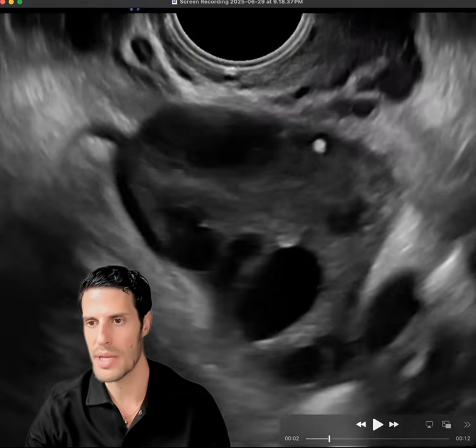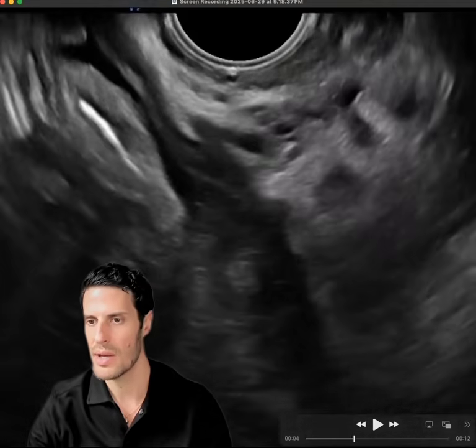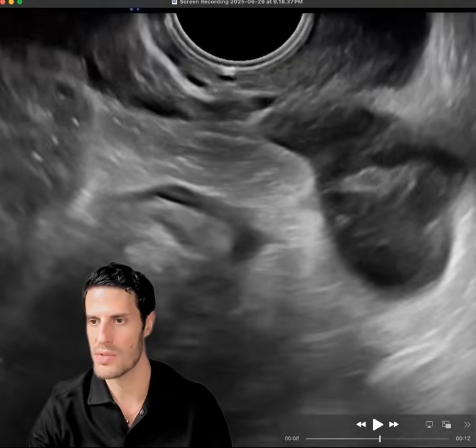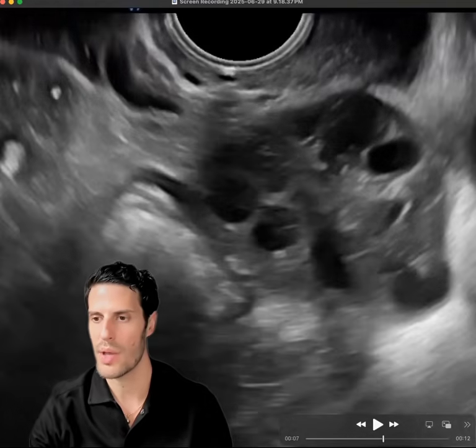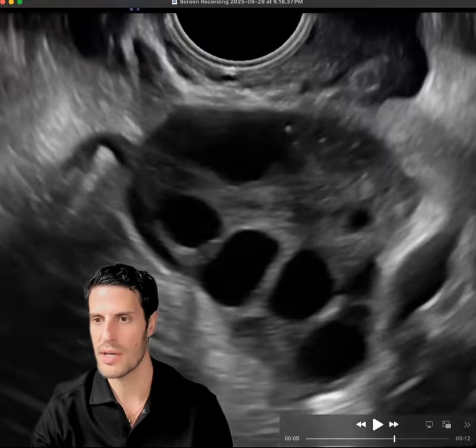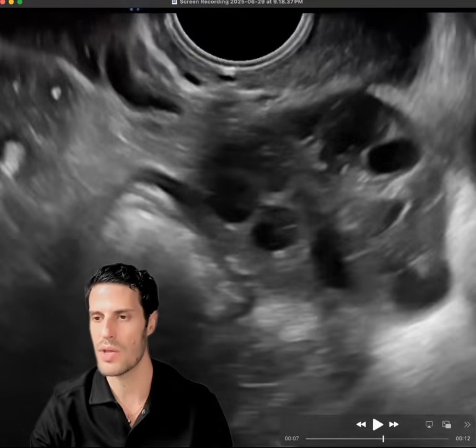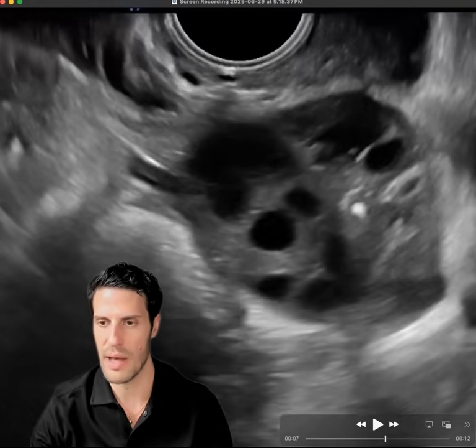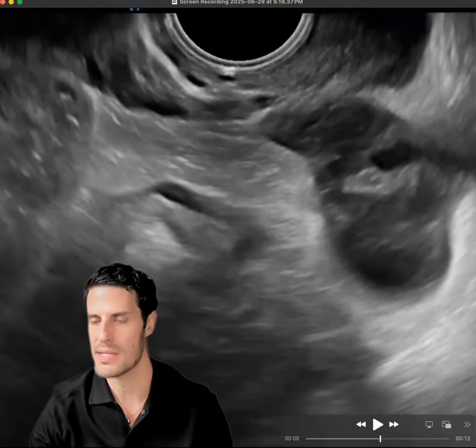So we have the combination of these hyperechoic foci, irregular border of the ovary, and we know from what we saw at the beginning, which is coming up again just here, we have this tubular structure sitting outside the ovary. All in, to me, this is representing endometriosis with a fixed ovary at the sidewall, right there, and likely fixed fallopian tube between the ovary and the sidewall, with a collection of blood within the fallopian tube in the form of a hematosalpinx. You could confuse this with an ovarian cyst, but this to me seems like it's distinct.